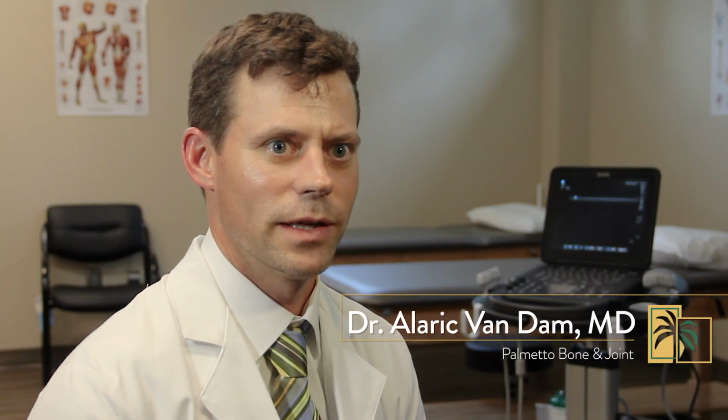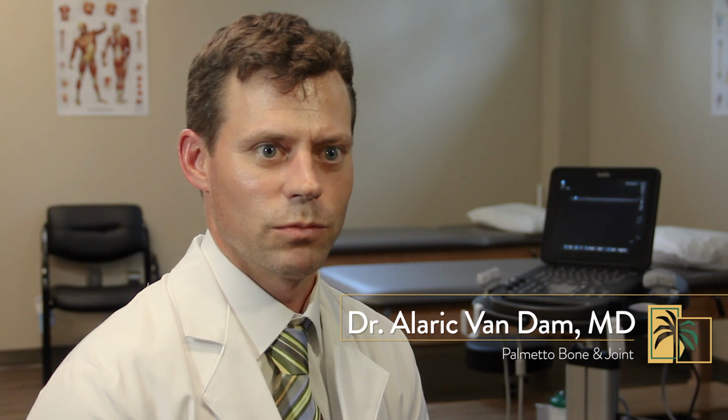Used to be, a long time ago, physicians had three basic ways to determine what was wrong with somebody who might have a musculoskeletal problem. We had a history, a physical, and an x-ray. So the doctors would rely on a history to see, well, what's the problem? What do you feel? And how is it bothering you? How did it happen? That kind of thing.